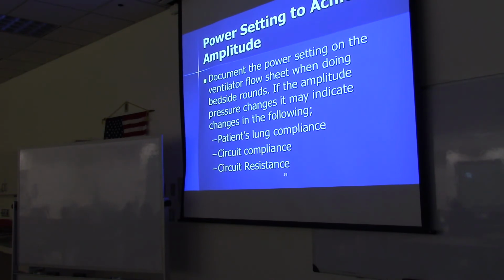If you have water in the circuit, it changes, I don't know if it changes the amplitude. All right, I'm gonna let that one go because I know circuit compliance, circuit resistance will affect mean airway pressure, but I wasn't aware that it can affect amplitude. So we're gonna leave that off the list for the moment.